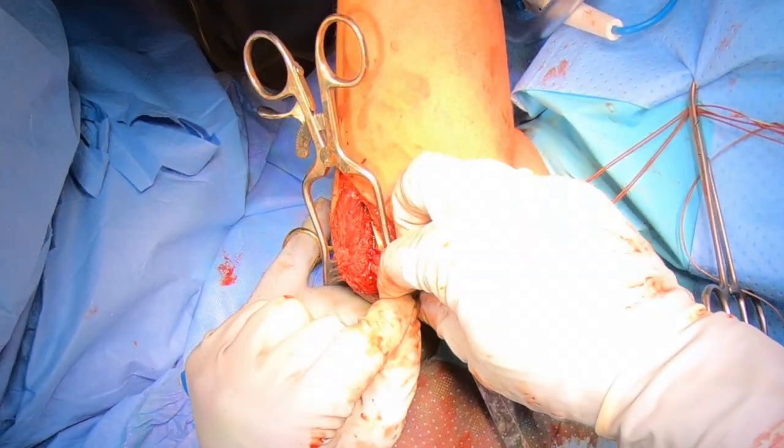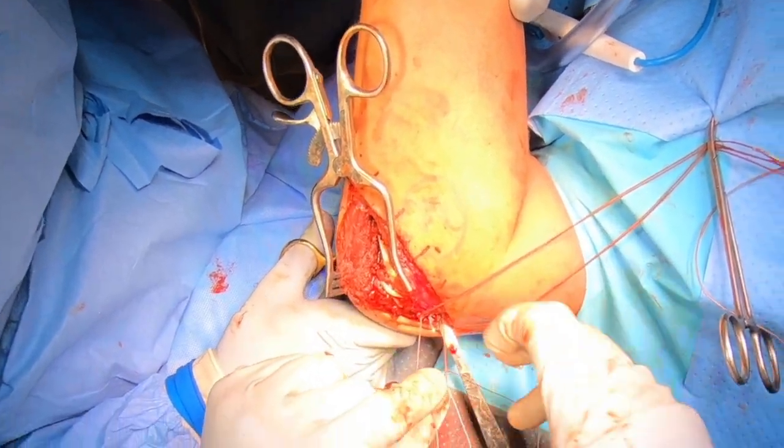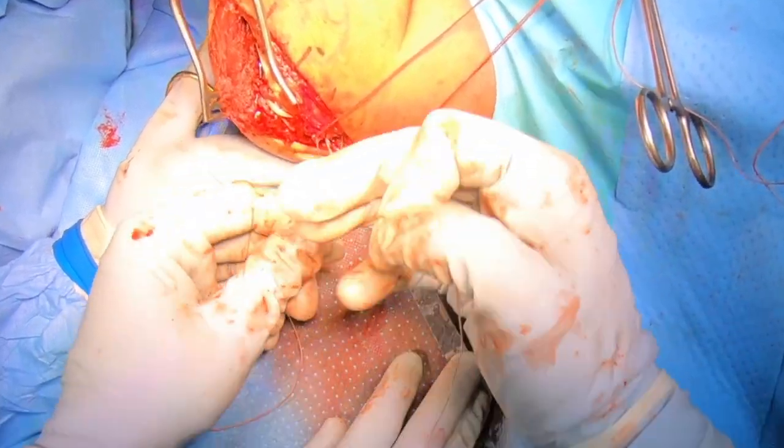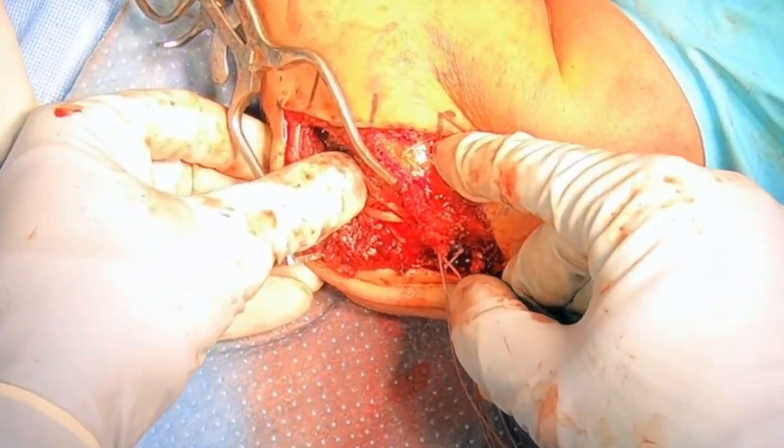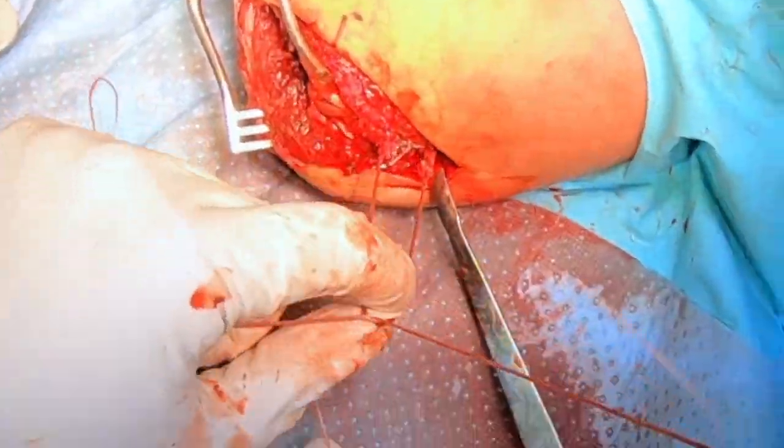We'll do another one — we have two ligament repair sutures to be extra sure that the ligament is repaired. We get that one tied and cut. Once that's completed, you can see I have complete stability now of the elbow — zero signs of instability.